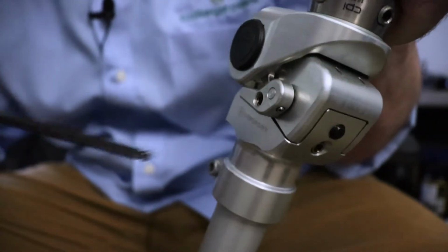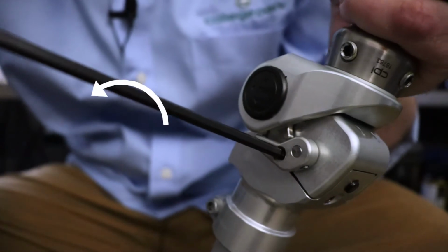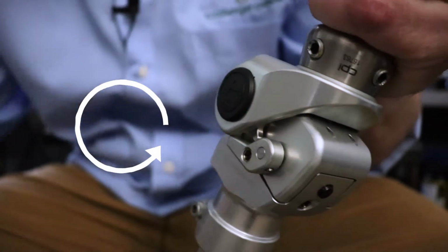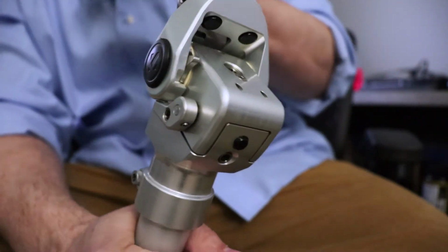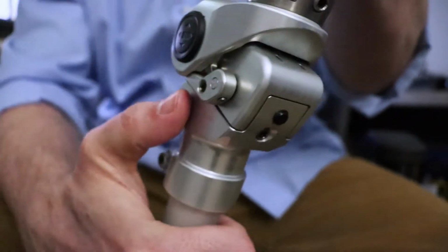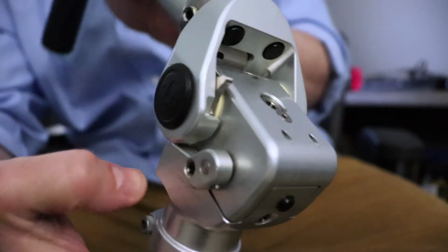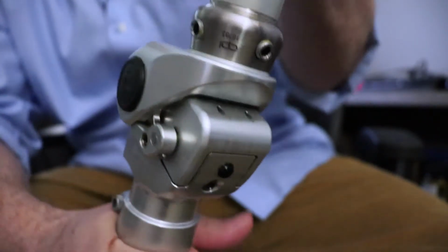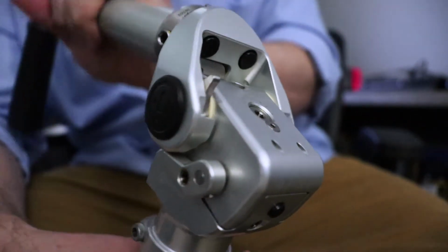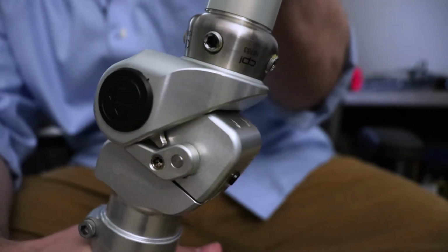Now if I just take my 4mm wrench here, I'm going to turn this fastener to the left, one full turn, and now if I open the knee and close it, you hear it click, and now it's locked. Now I can do this by hand. Normally you would use a cable here, but I can push it down with my thumb and get it to unlock, and then it just locks again. So again, I can push it down with my thumb to unlock it, and it clicks to lock.